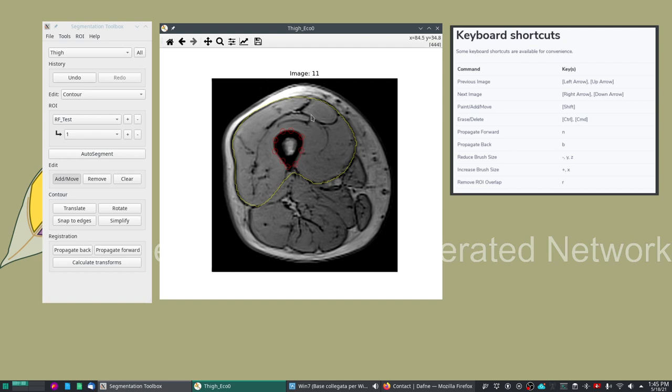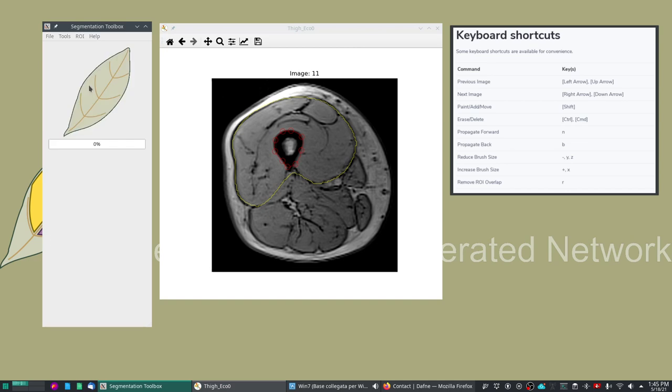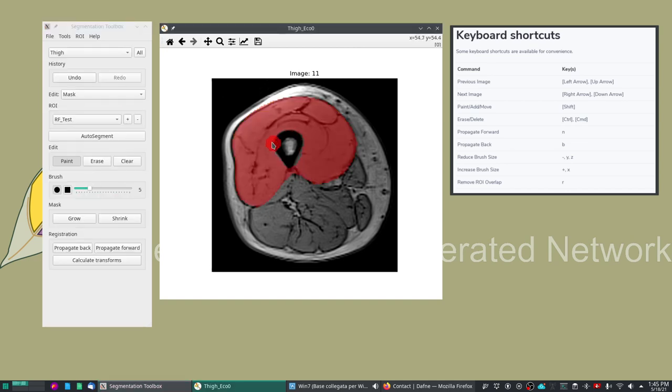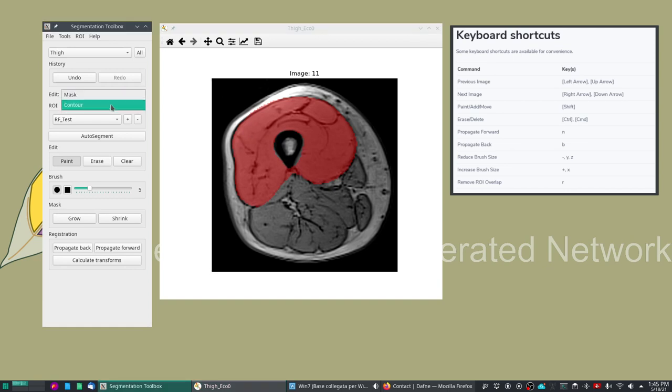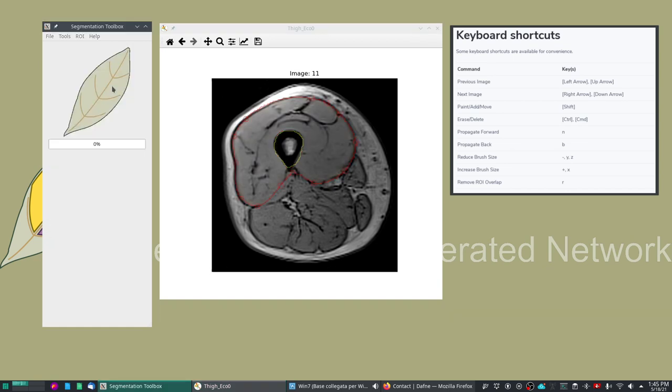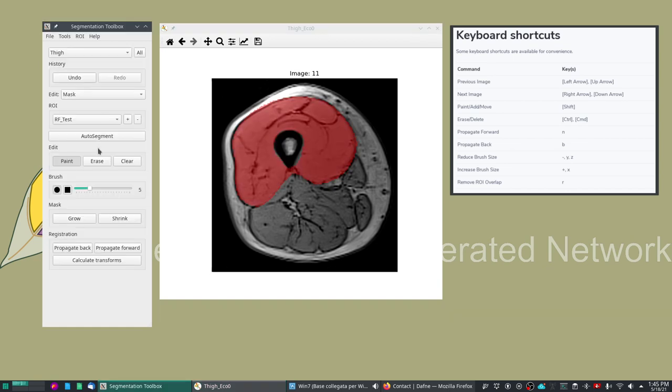This can be seen by switching from contour to mask mode. So this is a way of switching between the two edit modes and in principle you can switch from one to the other seamlessly.